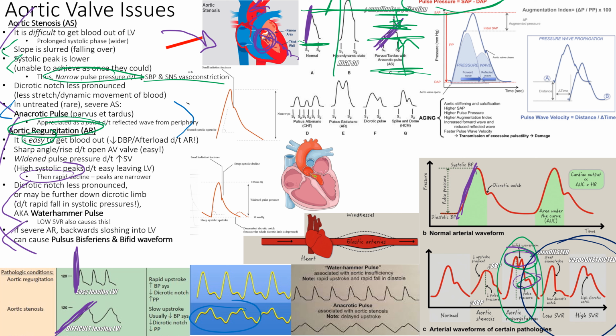So it's all backed up. You're going to have a wider width of our waveform compared to if everything's open, right? You're going to go right into the ride, right? So you're going to go straight on through, and there's going to be no wait, right? It's going to be super easy to get the blood out, hopefully, and then it's going to be super easy to get the blood through into the periphery.